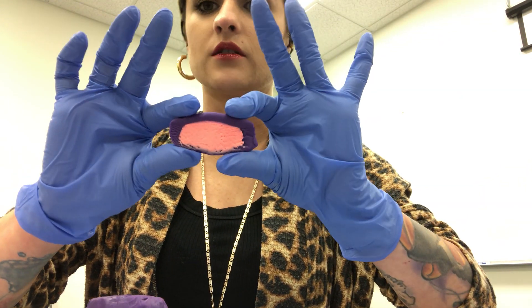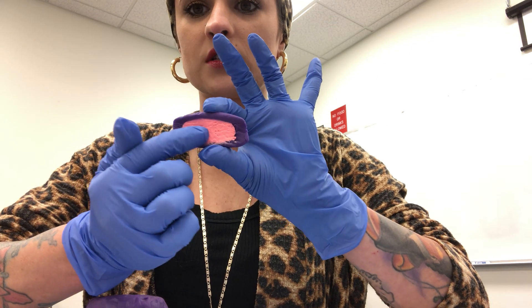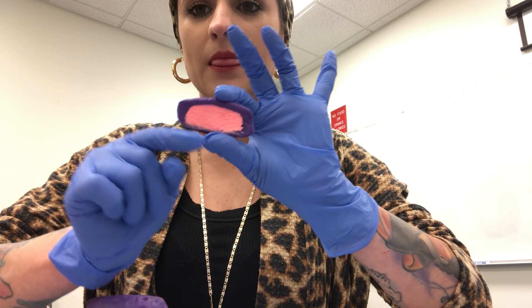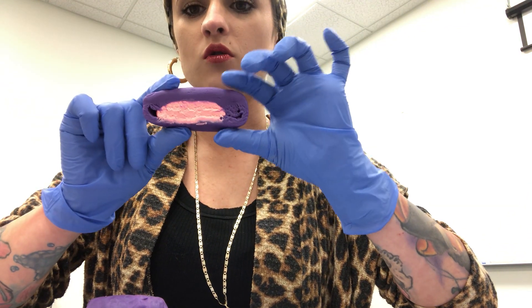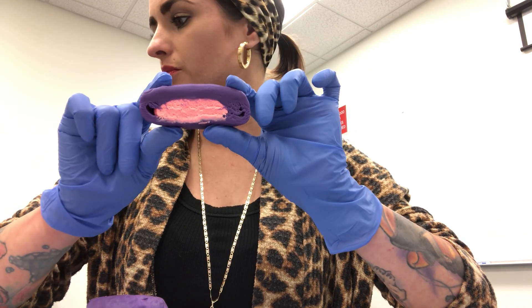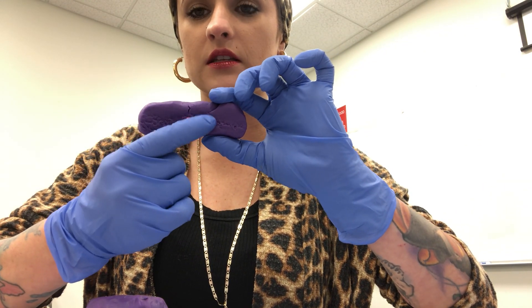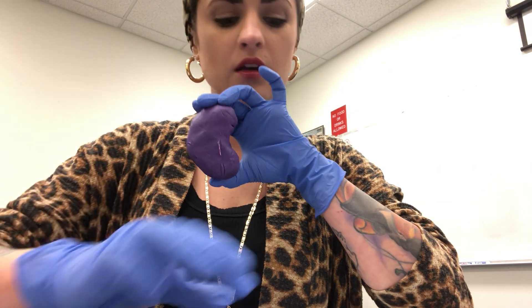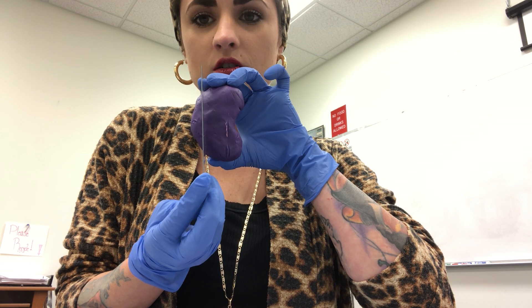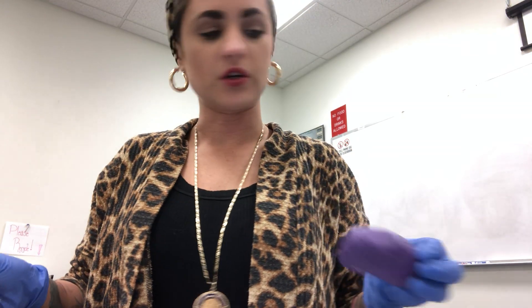To review our sagittal cuts: the lateral portion gives you a very little sinus with a nice clean ovoid piece. The mid portion has a lot more sinus, it's a little bit longer and still really oval - this is your longest axis for the mid measurement. The medial portion is where you'll have that nice little break in the actual cortex. You'll still see a little bit of sinus, but what we look for in the medial portion is that break in the cortex - that's just because of the hilum when scanning anterior to posterior.